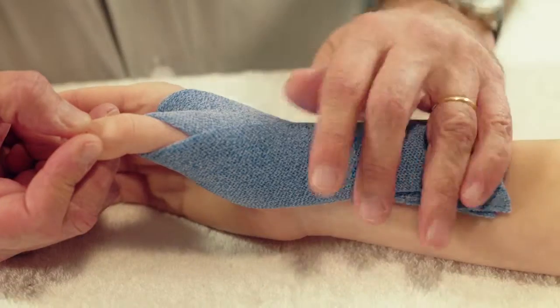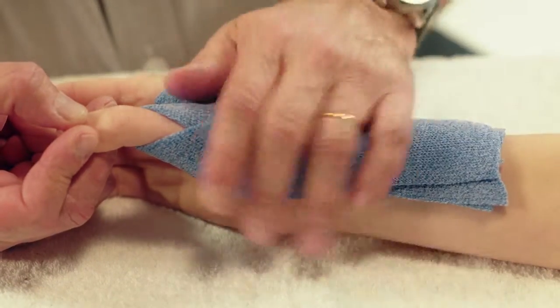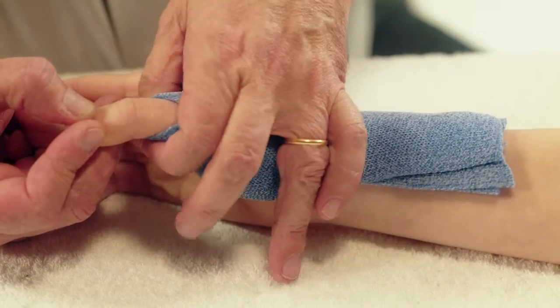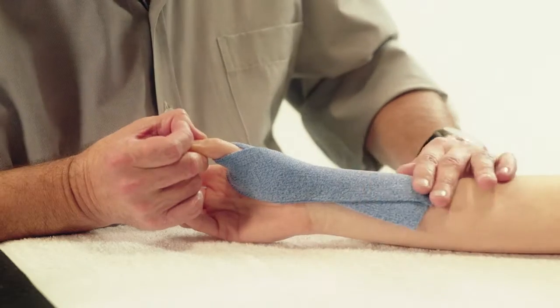Hold the thumb in a functional position while avoiding any radial slope. Mould the orthosis to conform during the hardening time.